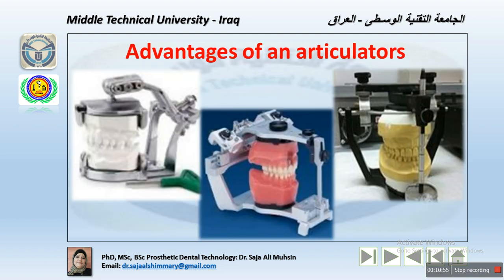Now, what are the advantages of an articulator? What is the benefit of it? We have mentioned previously the uses of it. Now, the advantages of properly mounted casts. The properly mounted casts allow the operator, whether they are a practitioner or dental technician or any operator, to visualize the patient's occlusion, especially from the lingual view.